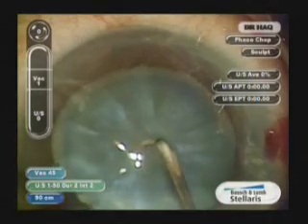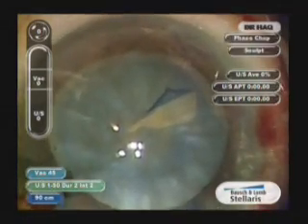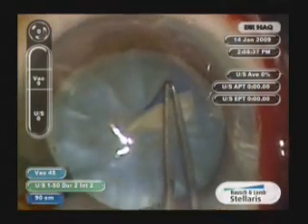An incision is made in the central part of the nucleus. This is an older patient so there is not a lot of white protein causing pressure. However, it is quite a big cataract and the capsulorhexis is perhaps a little more peripheral than we would like.